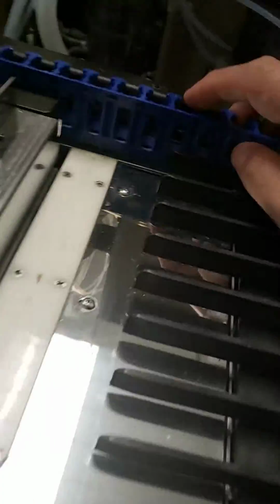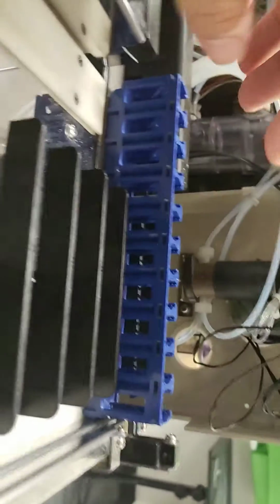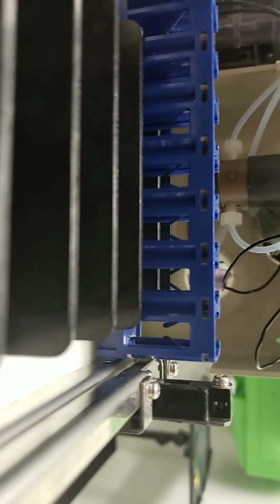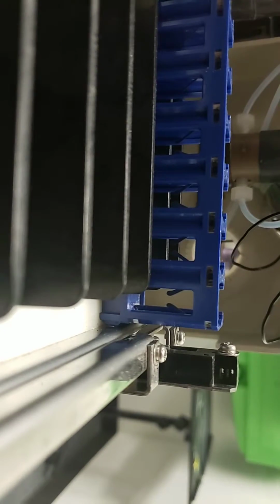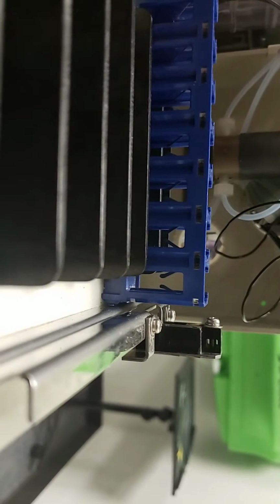So the easiest is seeing the transition itself. So if you put a rack right here, the rack should not be front heavy or back heavy. I mean, if you push on the back, you might be able to pick it up just a hair. You can see that right there. You want a little bit of a drop off because the way it works, it's all gravity. So the belt is basically dropping down onto this platform right there in the corner.